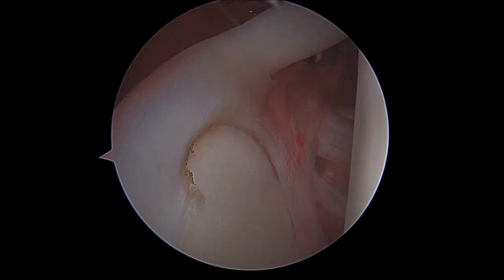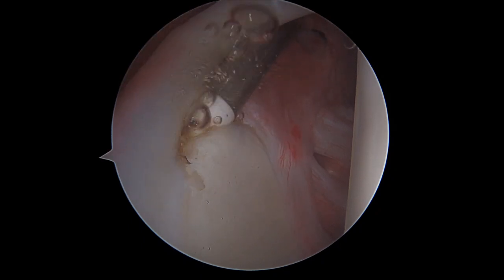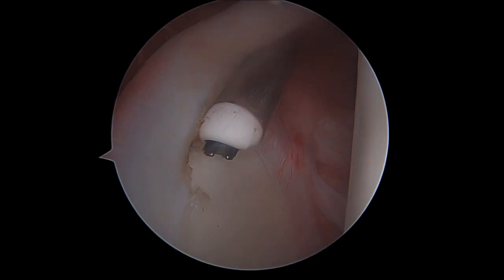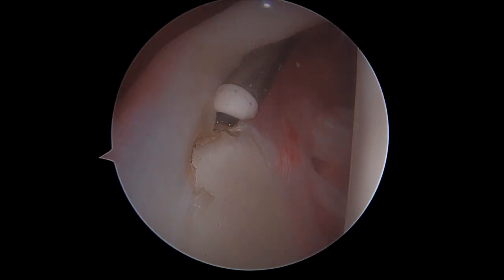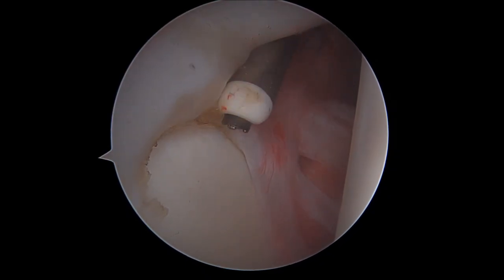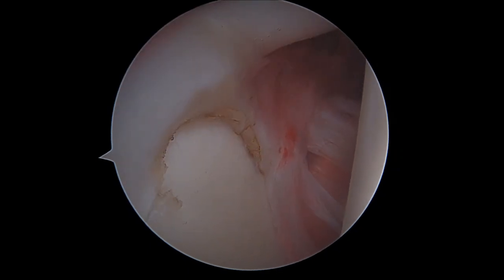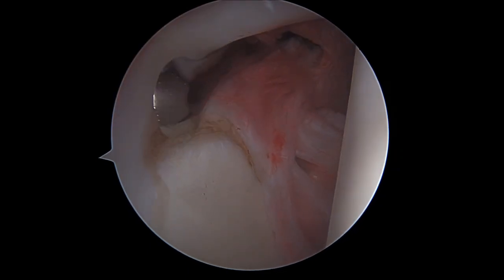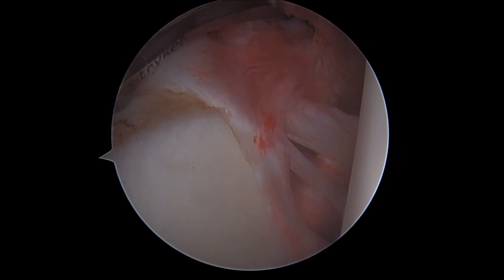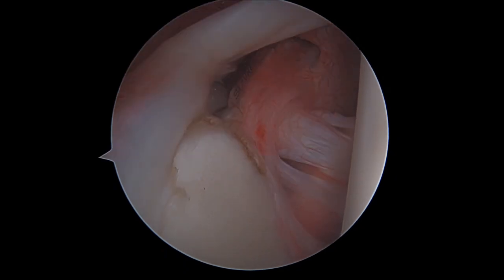What we do in this case is to first introduce our radiofrequency tool and to detach the residual fibers of the lesion, in order to have a totally free segment of the upper labrum and insertion of the long head of biceps on the upper pole of the glenoid cavity. We then introduce our arthroscopic scalpel and finalize the detaching of the residual fibers, fully mobilizing the torn aspect of the upper labrum.